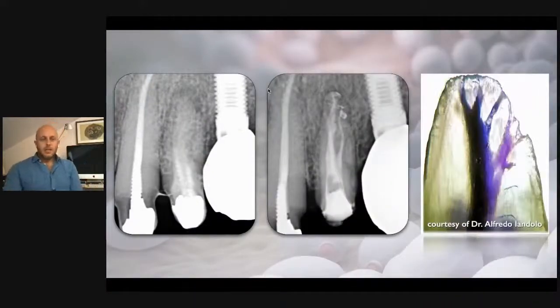This is another case of retreatment with this complex anatomy perfectly cleaned during the irrigation procedures and then filled with the sealer and the obturation material. Not depending on which kind of files we use to shape the root canal, and not depending on which kind of obturation material or cement or sealer we use, we have to clean the endodontic space in the best way possible, and the material will fill the cleaned space.